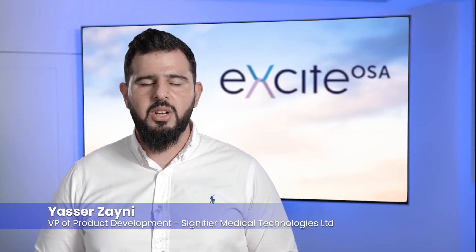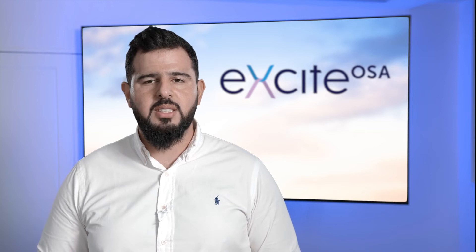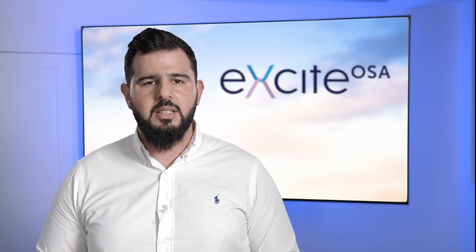Hi, this is Yasser Zaini from Signifier Medical Technologies. In this video clip I'll talk you through starting your first eXciteOSA session and specifically the device setup.